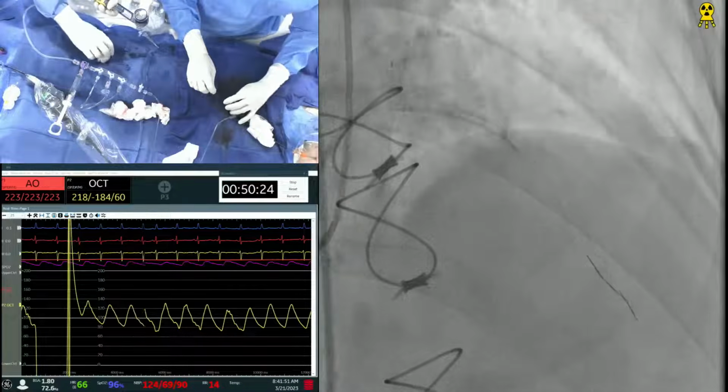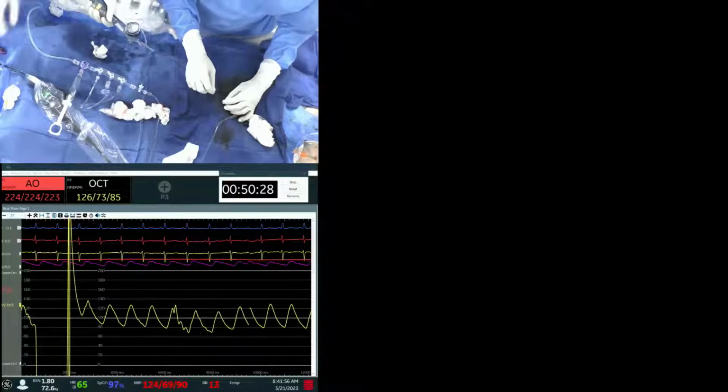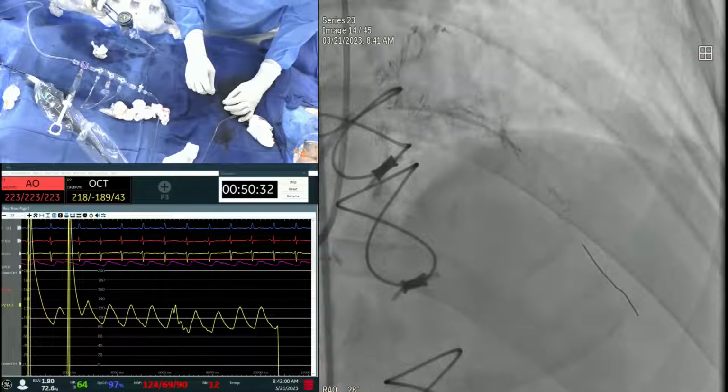No, you have to cover the left main. Yeah, ostial LAD is covered. Good. Okay, go cine. Go. I think we're good. Very good. Okay, go up, go up.